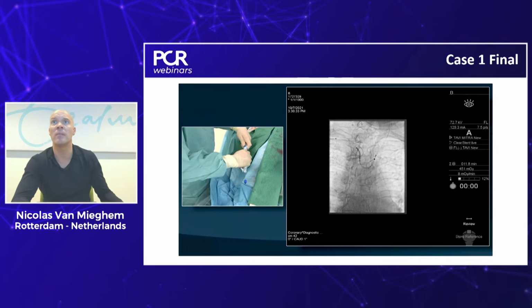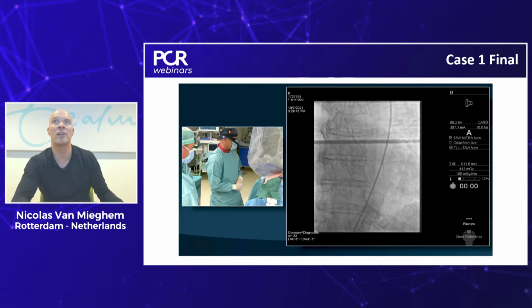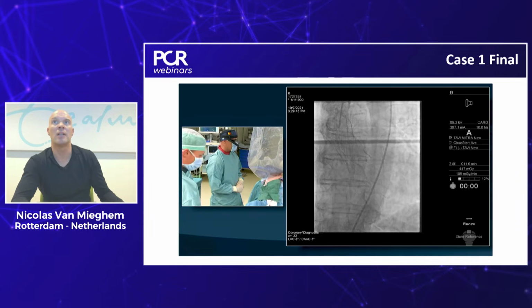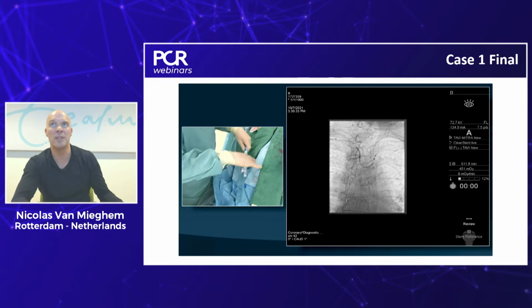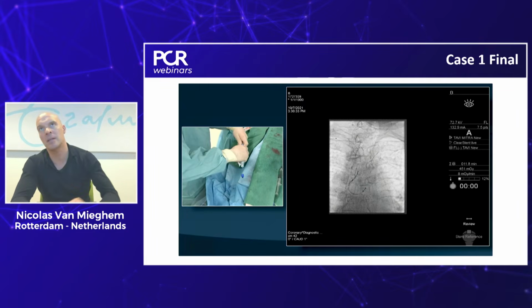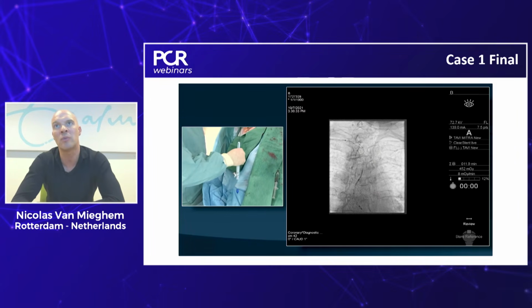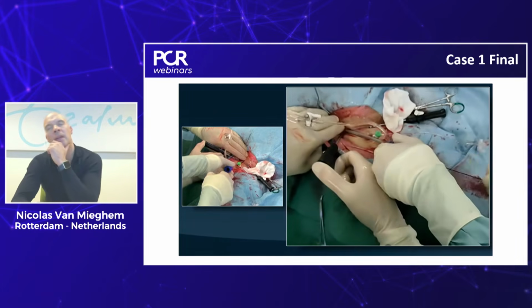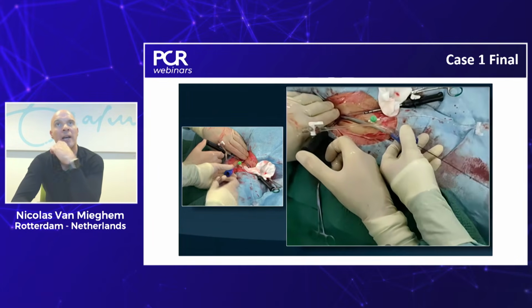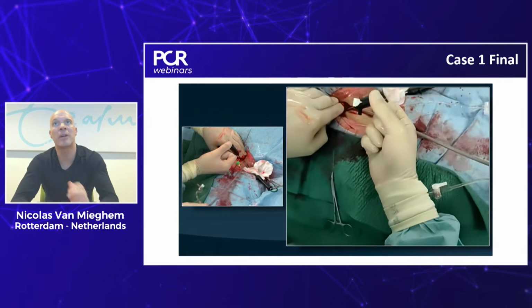At the same time, then it's the moment to retrieve our embolic protection device. That was the valve deployment. Yeah, this is already the aortogram, but you have to believe me that we did do a hemodynamic assessment at the end of the procedure before we made the aortogram. We don't do an echo anymore, so we rely on AR index and aortography to determine the paravalvular leak.